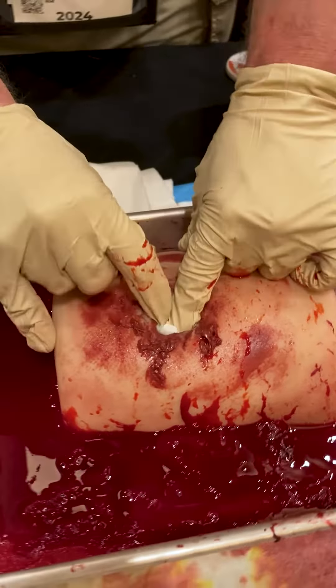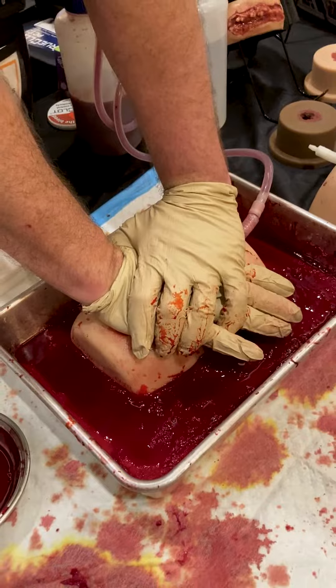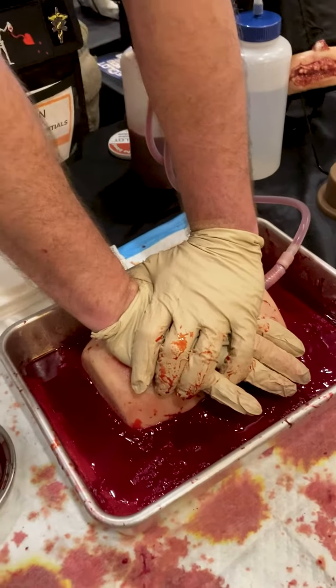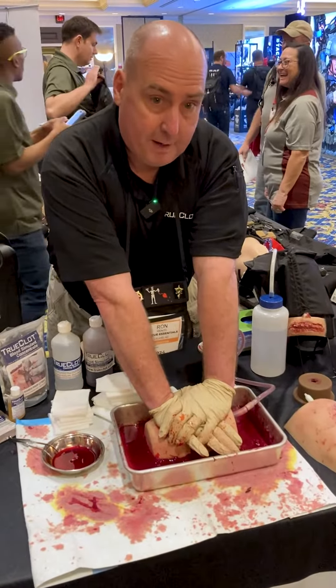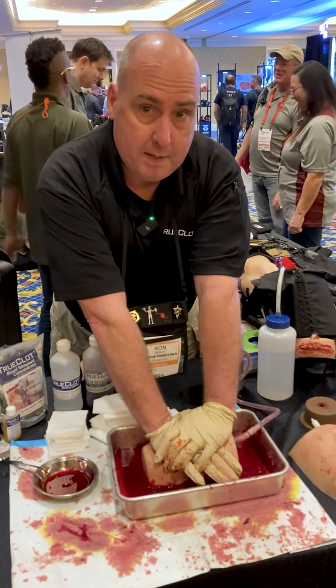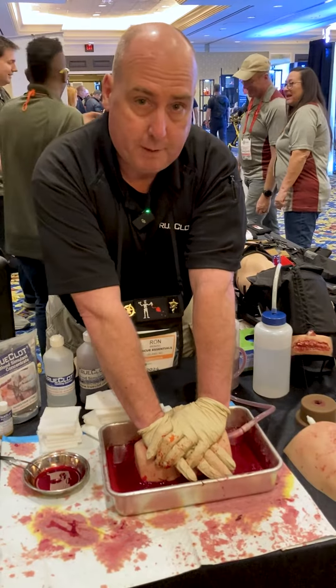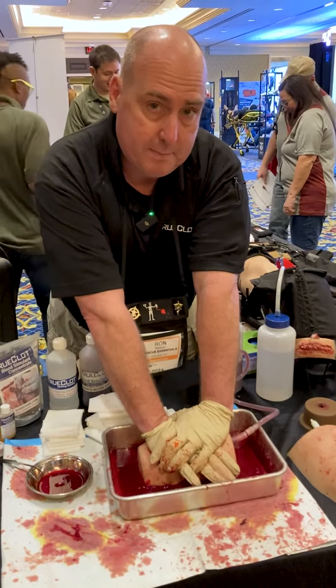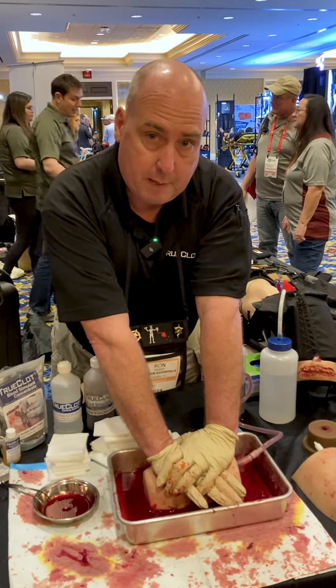Obviously I would be able to fit a lot more, but for the demo here, now I'm going to hold pressure. How long do I hold pressure? If I'm a bystander with no equipment, I'm holding pressure until first responders get there. If I'm medically trained with equipment — fire, EMS, or law enforcement — I'm going to hold pressure for three minutes with a hemostatic agent, or 10 minutes with regular Curalex that's not treated.